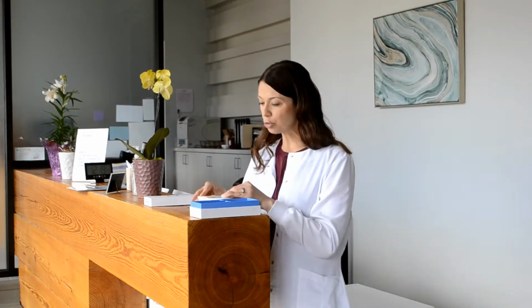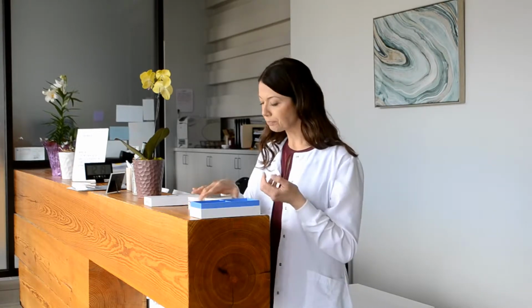After months and months of wearing this, that soft tissue repairs. And we find that you actually don't need to be as far forward as maybe you were in the first month of wearing the appliance. So it also heals whatever soft tissue is back there. Snoring increases that soft tissue as well. It almost forms a vacuum suction in the back of the throat, and so it also will heal that soft tissue from any snoring that was taking place before. Patients do report that snoring either ceases completely or is considerably less or softer with wearing this device.